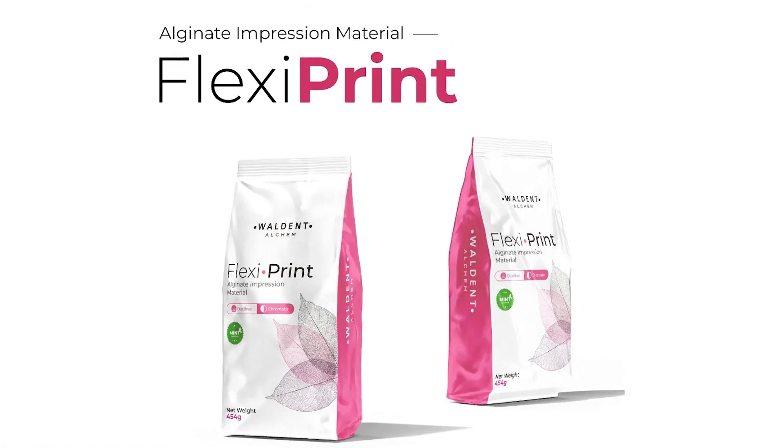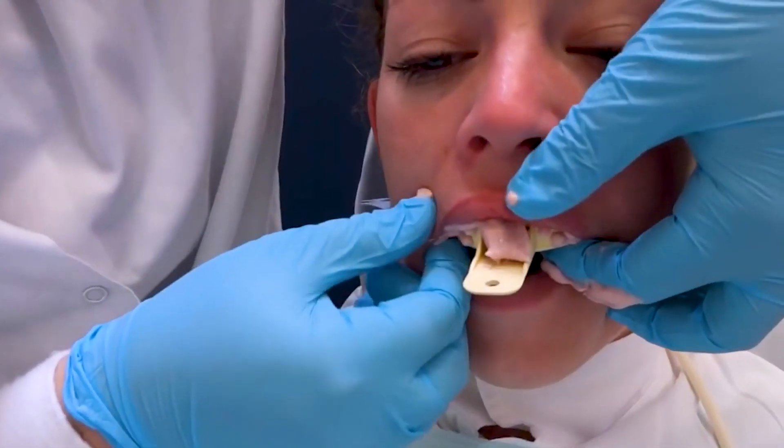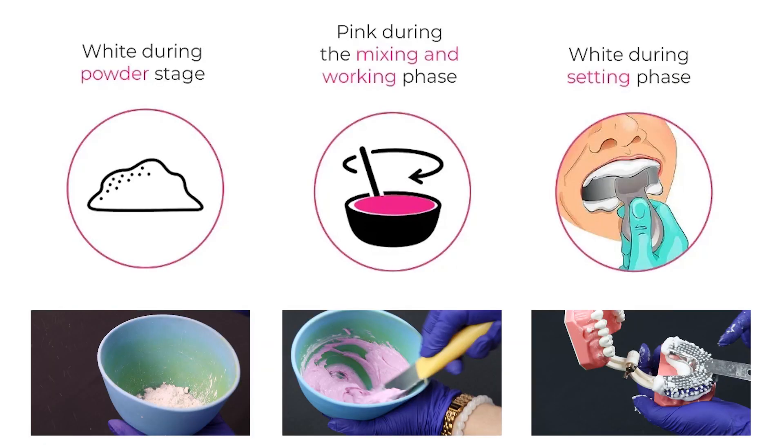Walden Flexiprint is a high quality three-phase chromatic alginate impression material that is completely dust-free. It gives a pleasing and comfortable experience to the patient and an easy identification of setting reaction for dental professionals.